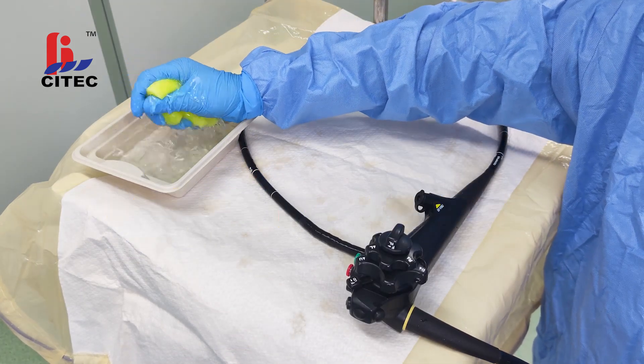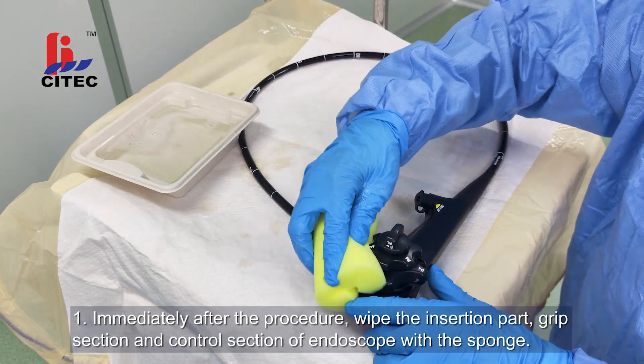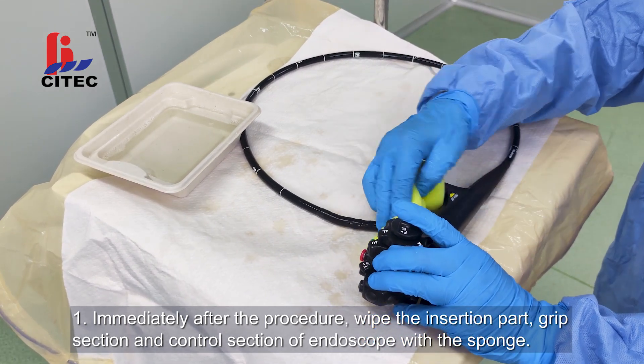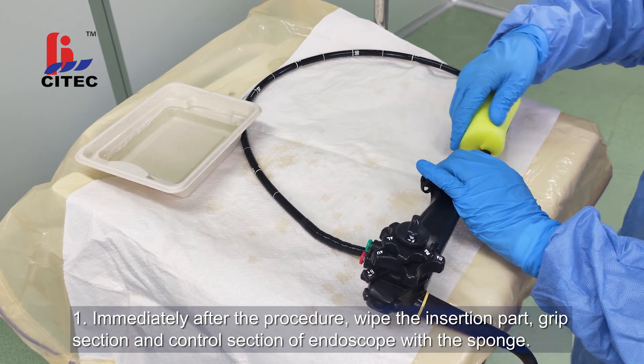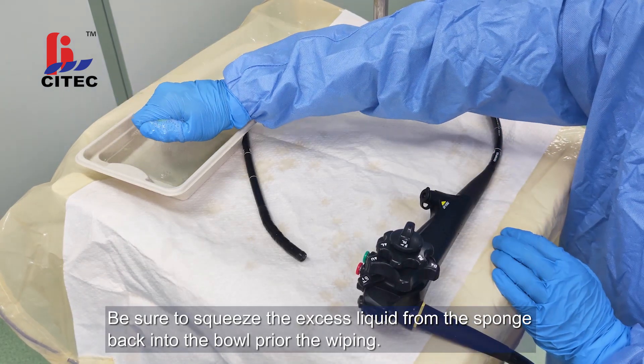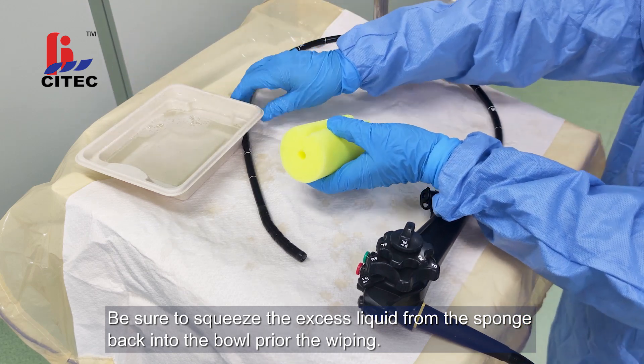Bedside cleaning. Step 8: Immediately after the procedure, wipe the insertion part, grip section and control section of the endoscope with the sponge. Be sure to squeeze the excess liquid from the sponge back into the bowl prior to wiping.